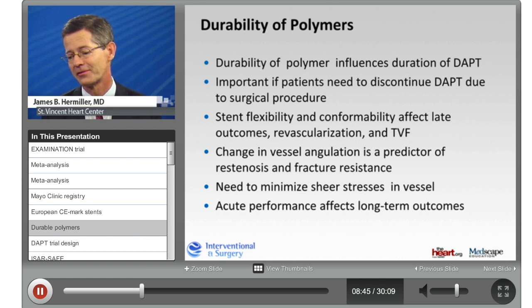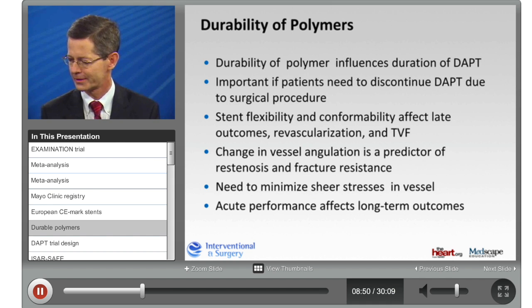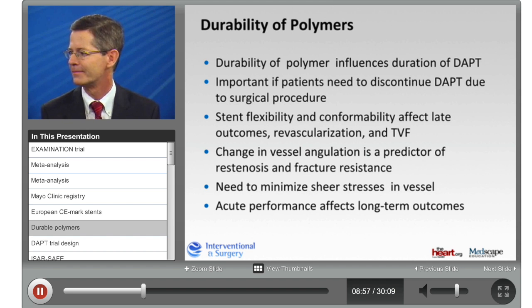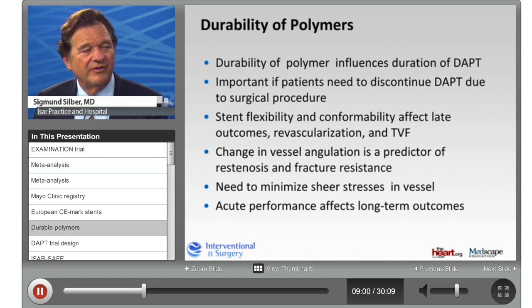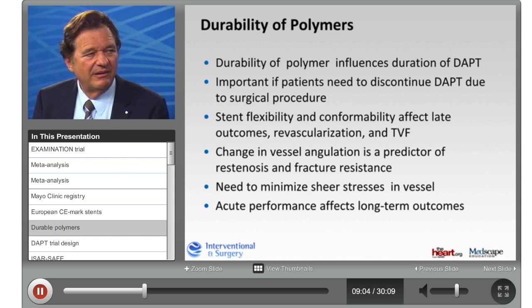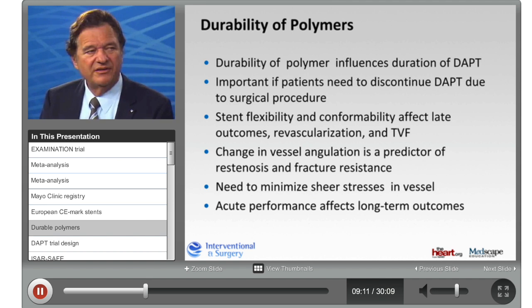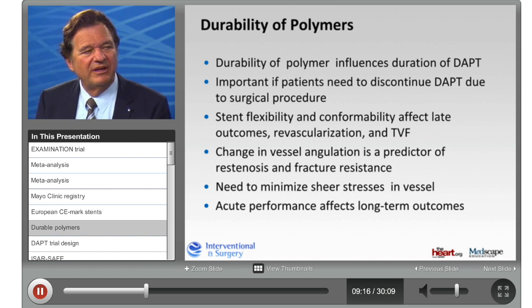Right. And this really gets to the question of, besides very little polymer, one that does its job and gets out, what other design elements would you say, hey, this is what I'd like to see in the next generation? I mean, the question is, what do I expect from this technique? What I expect is a shorter duration of dual antiplatelet therapy. So if the new stent can show that even with a shorter duration of drug release and a shorter duration of the polymer sitting on the stent, you can reduce your dual antiplatelet therapy at least for 3 months.